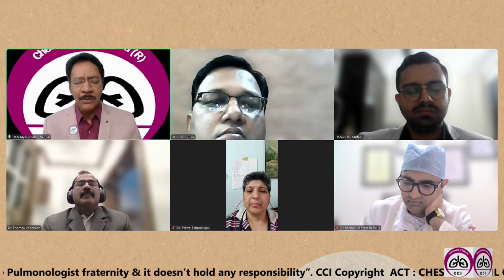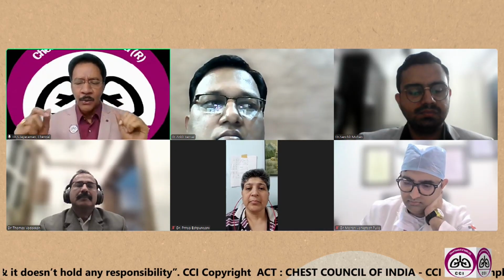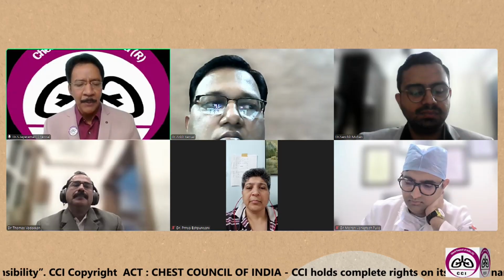So Ankit, may I ask one question? CT is an axial plane, but EBUS is a sagittal plane. So what is your personal mental framework to translate CT images into the real-time EBUS orientation?